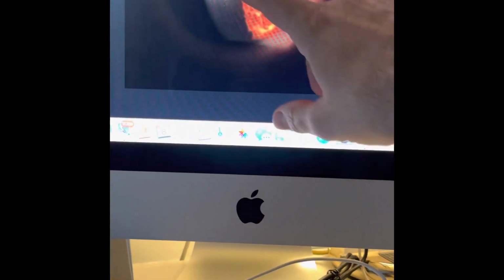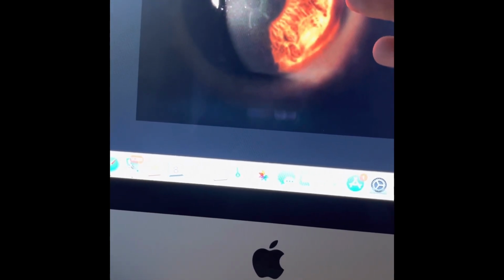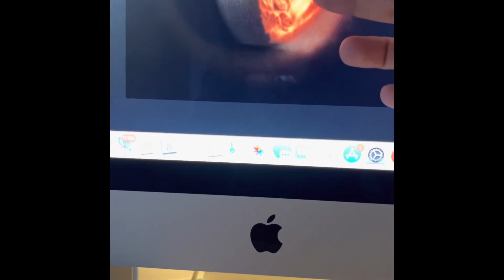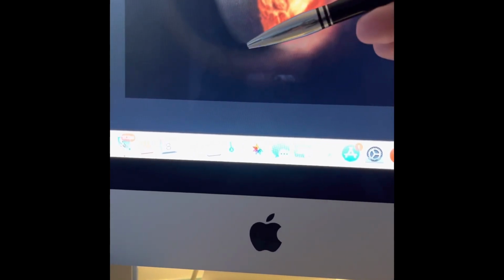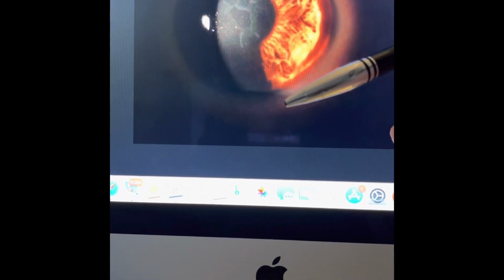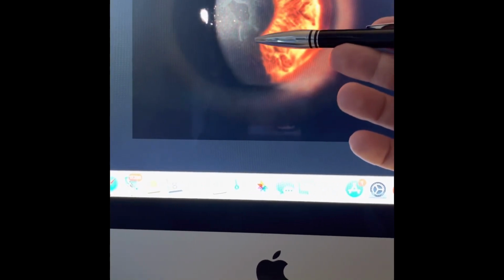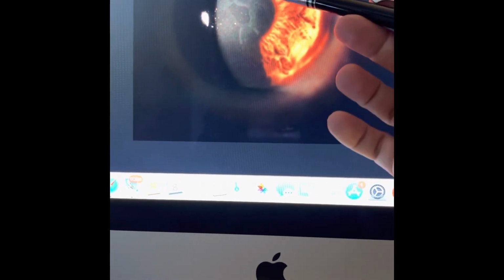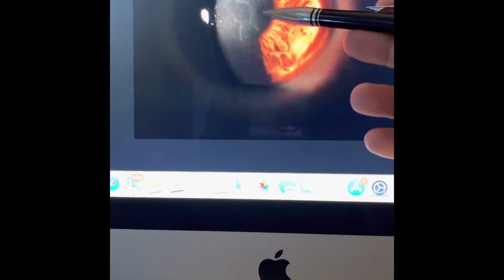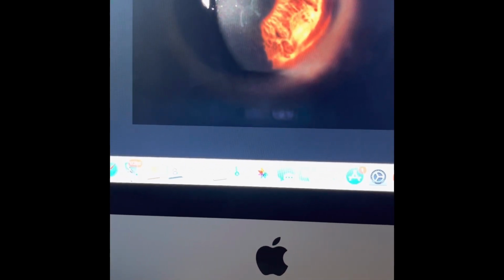Two weeks out, and there's still a persistent epithelial defect, and this is mainly the reason I'm showing this video. We will see a short video on how we dealt with this. Two weeks down the line, we can see necrotic epithelium heaped up around the borders of this epithelial defect. We have a bandage contact lens. We stopped using corticosteroids. He's just on moxifloxacin. Still, for a week, it's persisting. So what we're gonna do here is we're gonna take a step back in order to take 2 steps forward. We're gonna enlarge this epithelial defect, remove all this necrotic epithelium, and give the chance to the cornea surface to resurface faster.